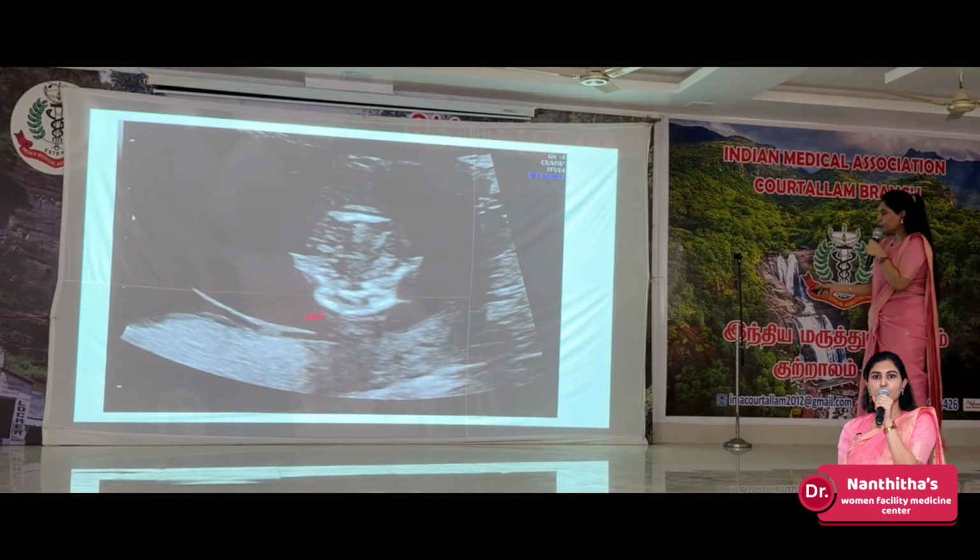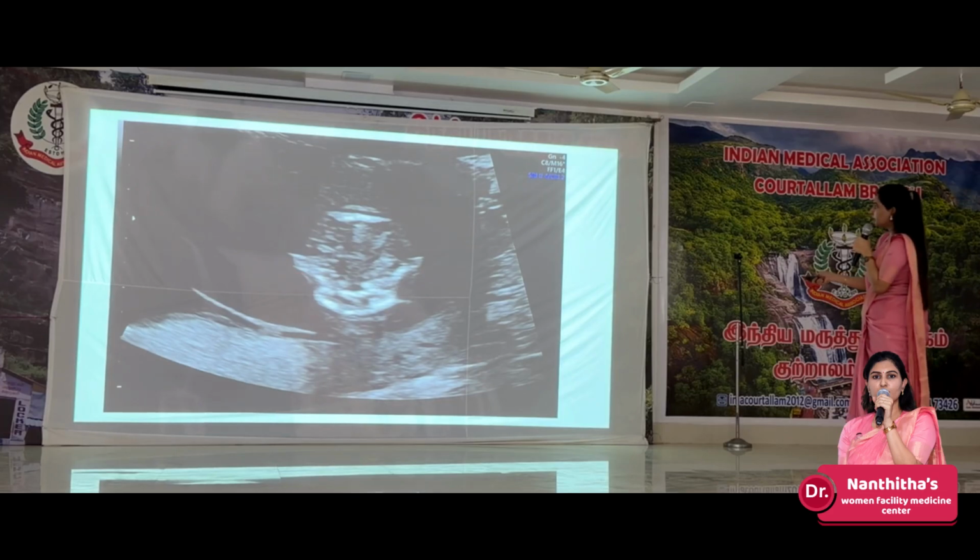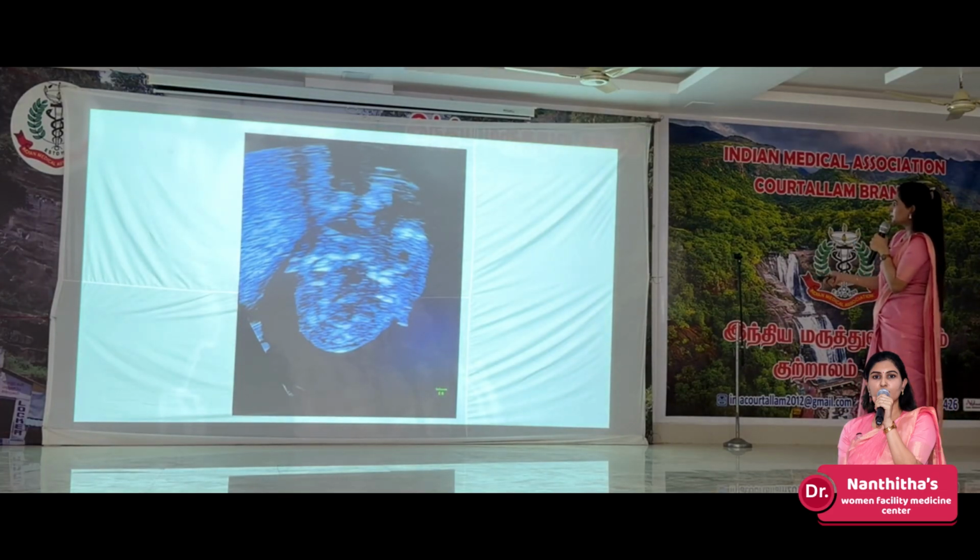This is not included in the protocol, but you can just add it. I feel like in first trimester it's easy to see the earlobes. So you can take it in either prone or supine. These are the tips of the earlobes of the fetuses.